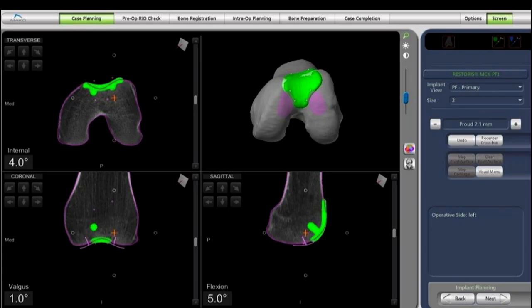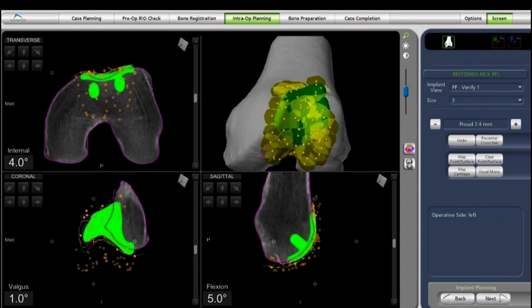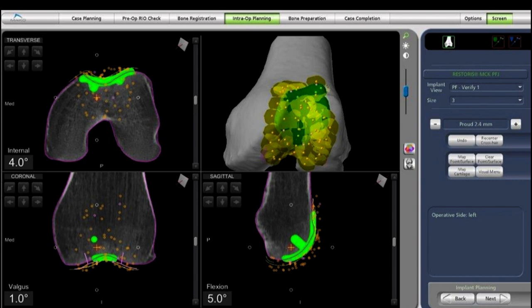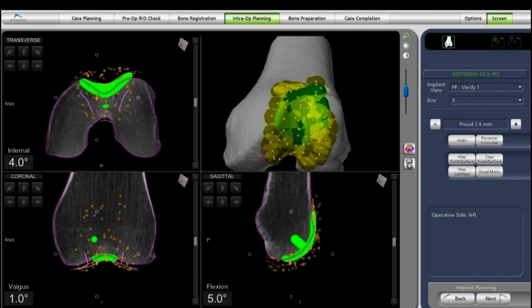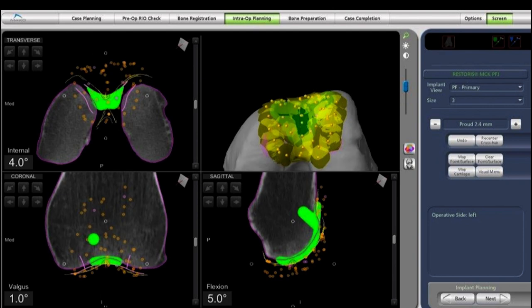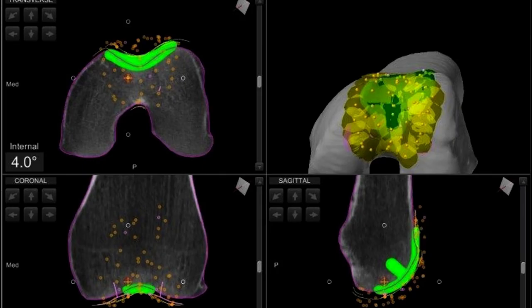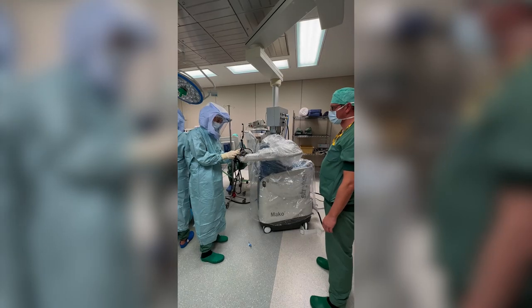The standing radiographs, AP and lateral, and the images from the virtual planning generated by the robot and the artificial intelligence in the software look quite good. We can still do some final adjustments once we are inside the knee, but the planning the robot has made looks quite well. We seem to have a good transition zone.